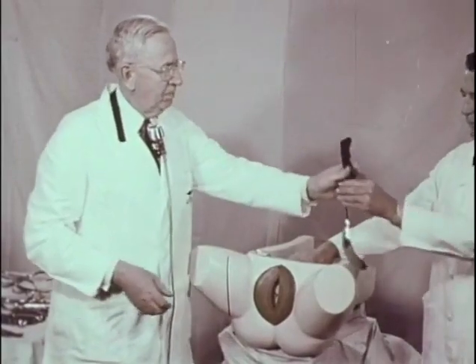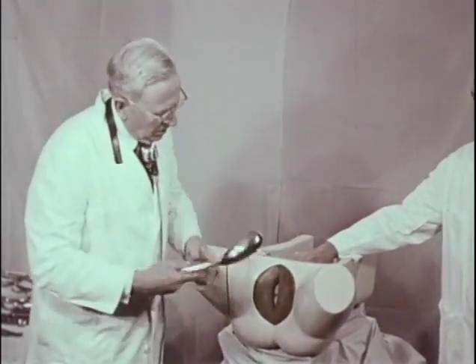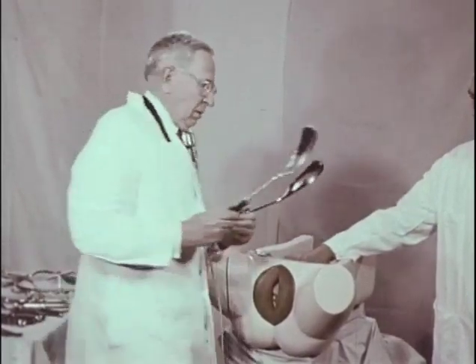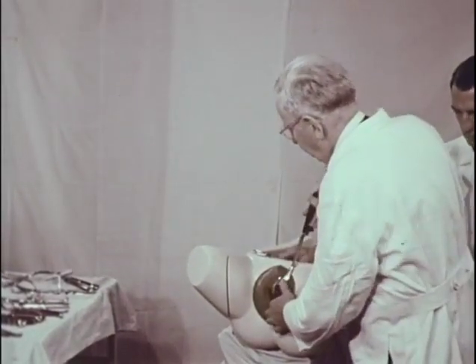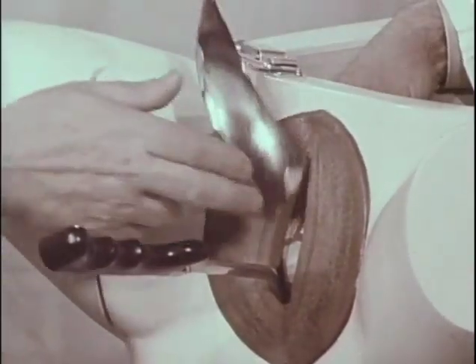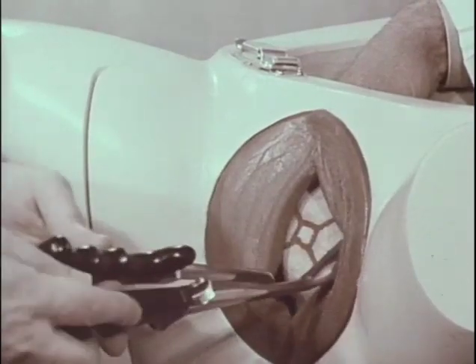In the LOP, we consider it temporarily to be an ROA in order to follow the technique of the posterior blade first, so that we'd apply the right blade, held in the right hand, inserted to the right side, opposite the baby's left ear. This is the first exception to the cardinal rule. There's 4 points of left blade, left hand, left side, left ear, because the head is upside down in the posterior position. It's necessary to cross the handles in order to lock them.